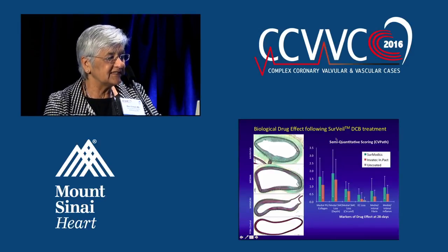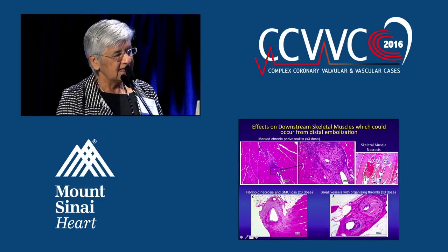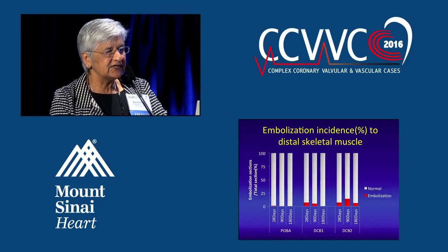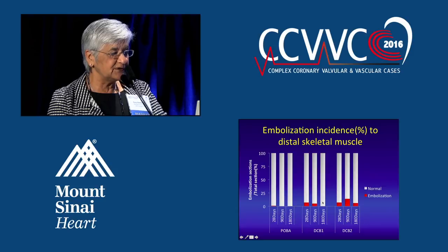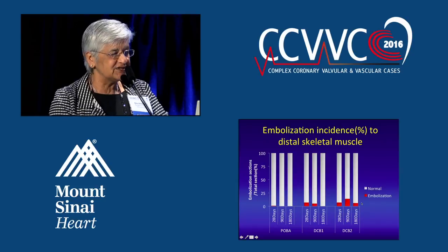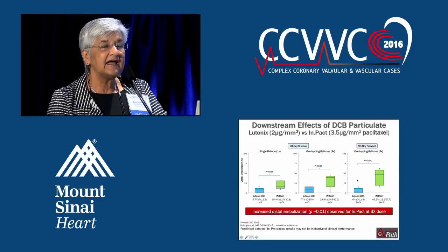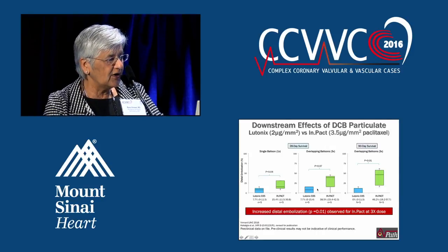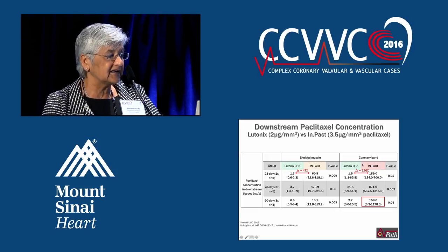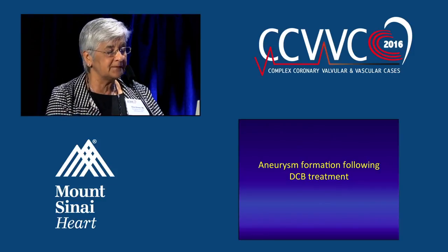What about the biological effects in the case of SURVEIL? They show even better, as you can see here very well. So distal emboli are important to look for, and whether there are any changes that are eosinophilic or not. You can see each balloon has its own, but we always see distal emboli somewhat. We must not see too many. Overall, you can see in Admiral Impact, we see much greater emboli, whether it's 28 days or 90 days. And the drug levels are also significantly greater in the Impact in the skeletal muscle as well as in the coronary bands. So aneurysm formation has been reported.